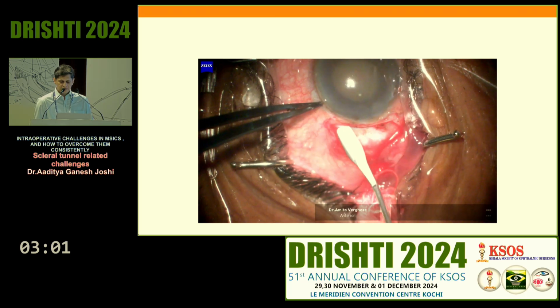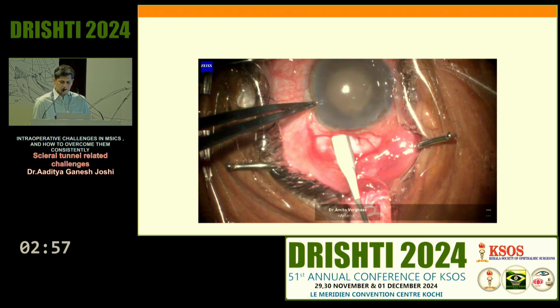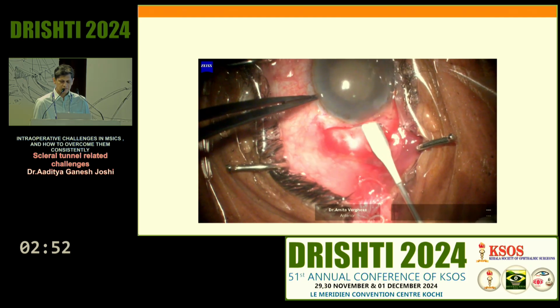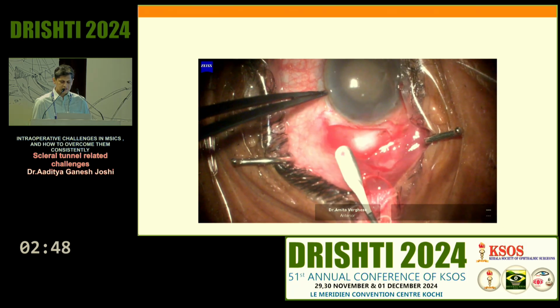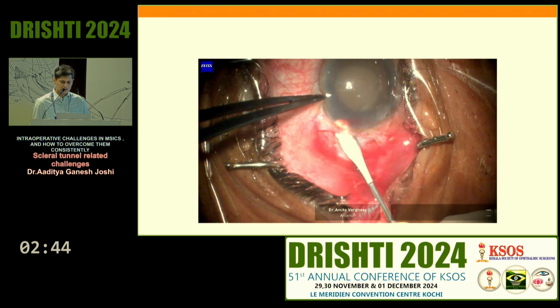In another case, the surgeon had this scleral flap cut, as you saw over here. But then he was skilled enough, he went from the other side, got to the correct plane, and then he could negate this scleral flap cut so that it doesn't go through and through.